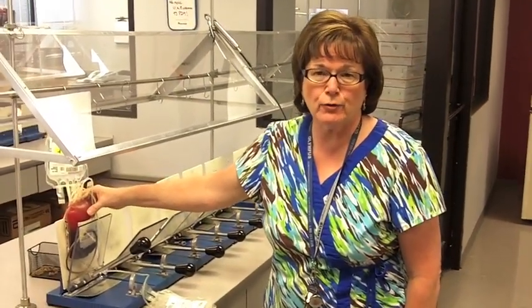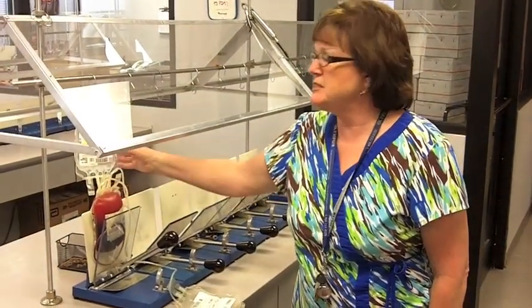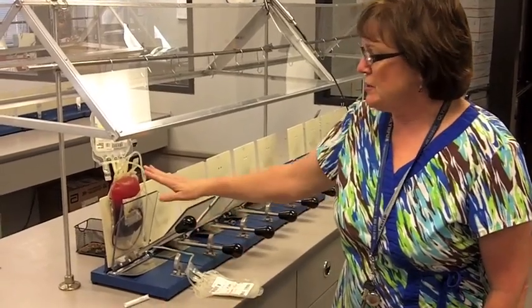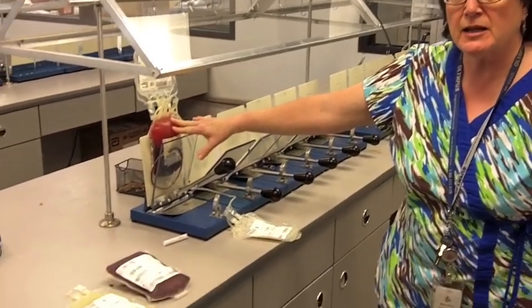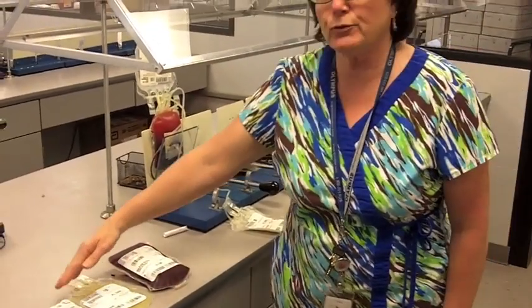After your blood is collected, as the testing is being done, we are also doing another process to the blood bags. The blood bag is collected in one bag for all of our collection sites. Then it is brought here to Blood Assurance, and we separate it out into the platelets and then into the plasma, and also then we still have the red blood cells. After this process is done by centrifugal force, we come up with 3 different products.